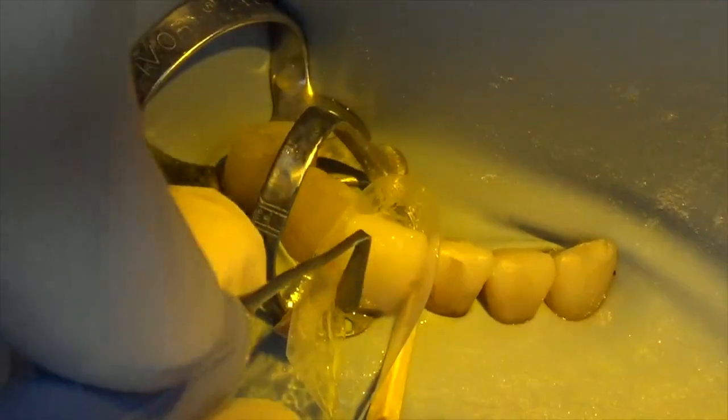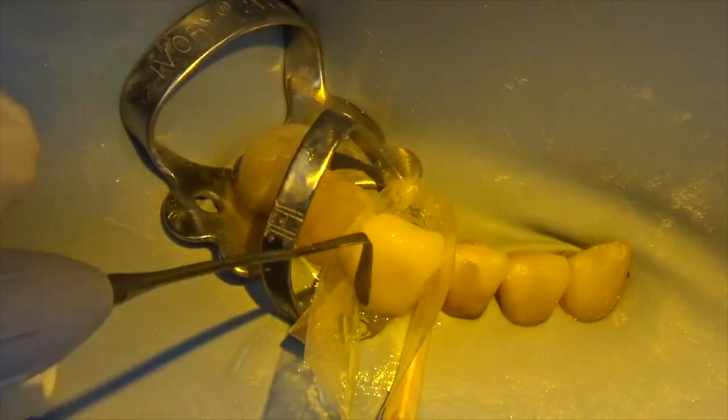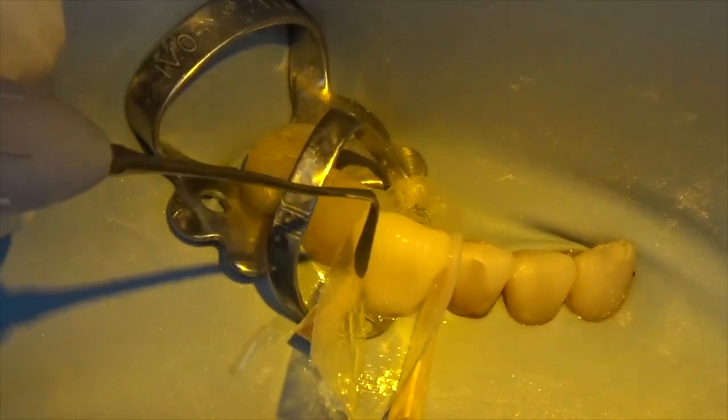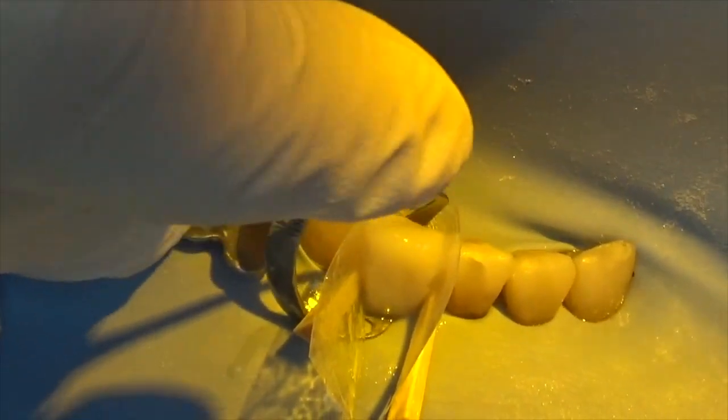If you do multiple layers, you'll end up with seams between them, get a lot more staining, and it will look great for the first month but worse after a year. Notice on the adjacent composite resins where they are seamless — there are no stains. It's only where there's a join or a weak margin.